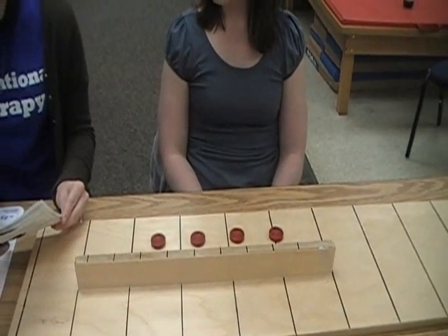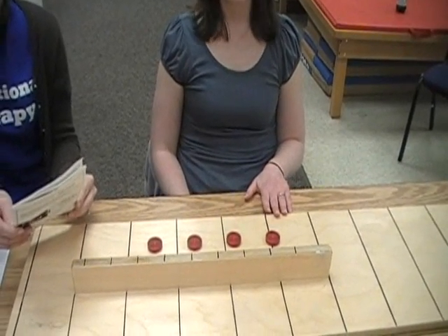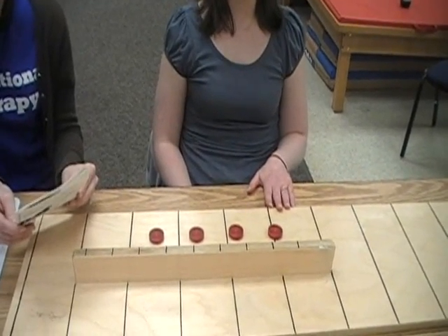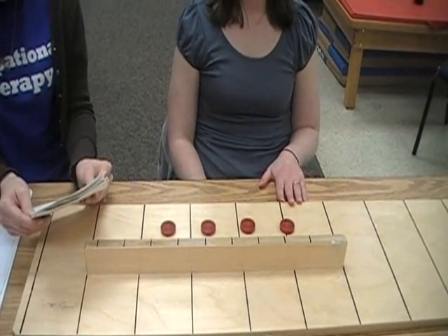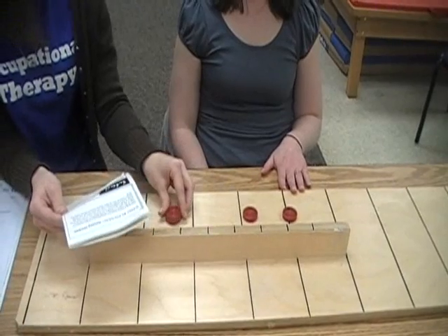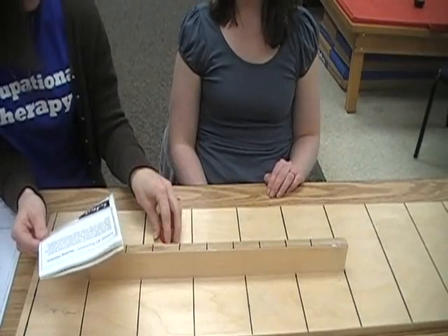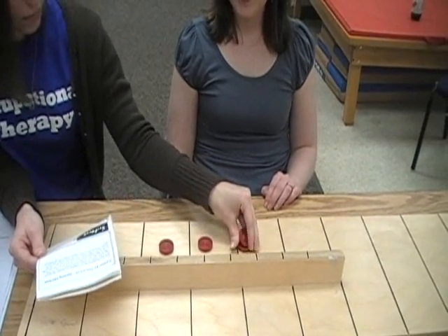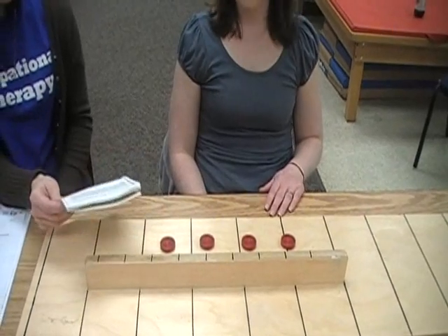Please place your left hand on the table. When I say go, use your left hand to stack these checkers on the board in front of you as fast as you can, one on top of the other. You may begin with any checker and do it just like this. Do you understand? Ready? Go.